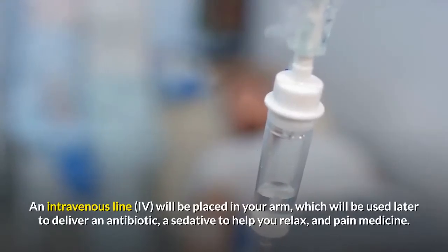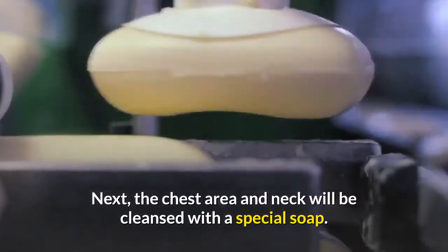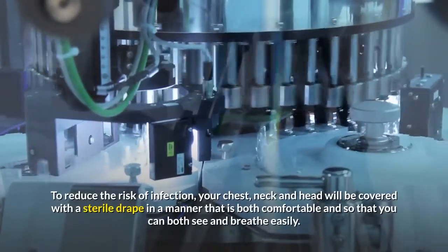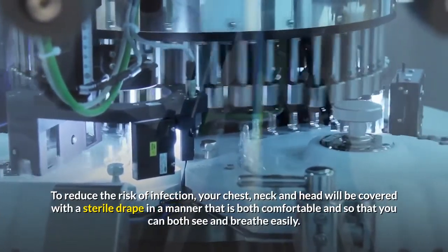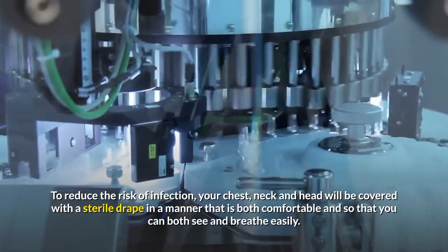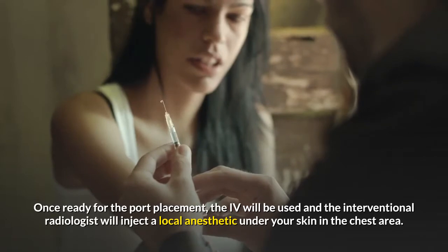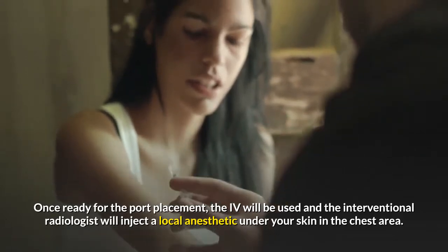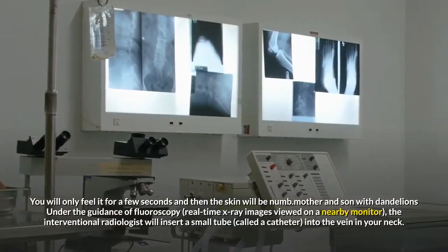Prior to the procedure, you will have had labs. An intravenous line, IV, will be placed in your arm, which will be used later to deliver an antibiotic, a sedative to help you relax, and pain medicine. Next, the chest area and neck will be cleansed with a special soap. To reduce the risk of infection, your chest, neck, and head will be covered with a sterile drape in a manner that is both comfortable and so that you can both see and breathe easily. Once ready for the port placement, the IV will be used and the interventional radiologist will inject a local anesthetic under your skin in the chest area. You will only feel it for a few seconds and then the skin will be numb.